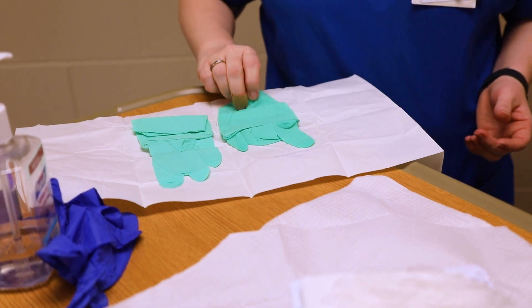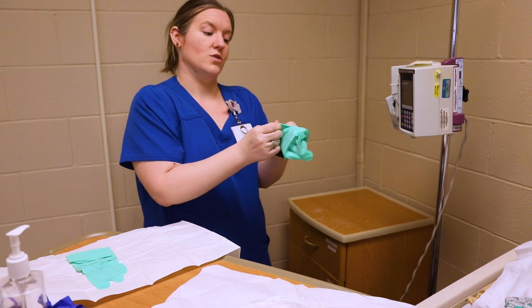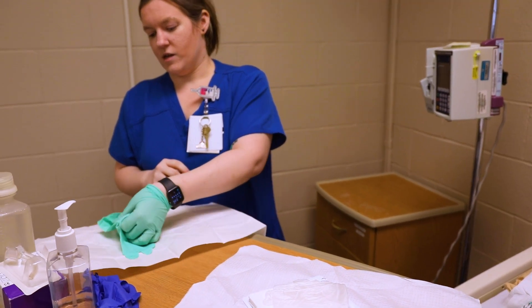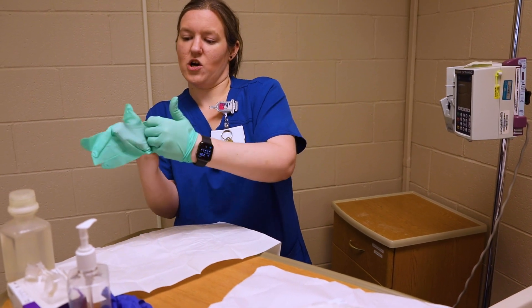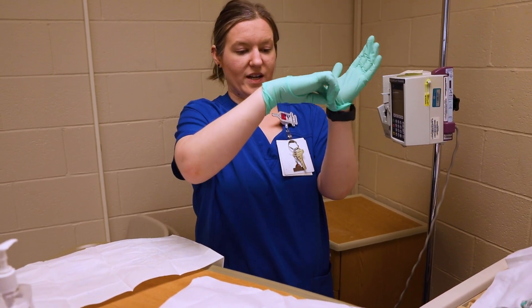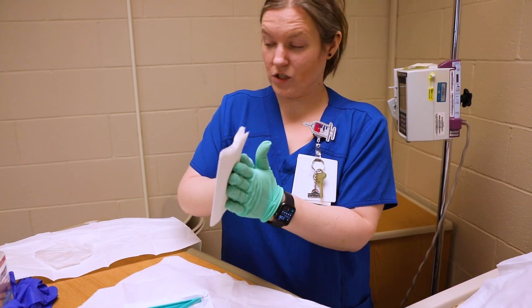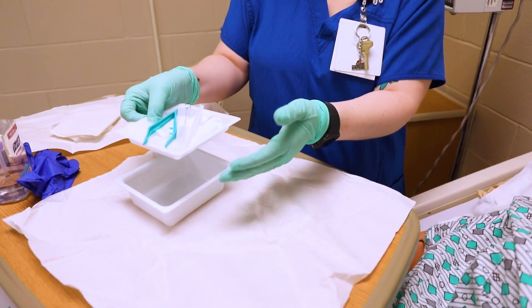I'm going to reach down here and pick up the first glove. I like to take a step back — especially in lab — so your instructor will know for sure you did not cross the barrier. I'm going to open this; once I get my fingers started, keep that thumb out so you don't contaminate. Now I'm going to set up my kit — I am crossing over that one-inch border but that's necessary at this point.